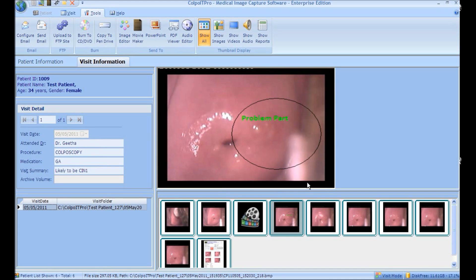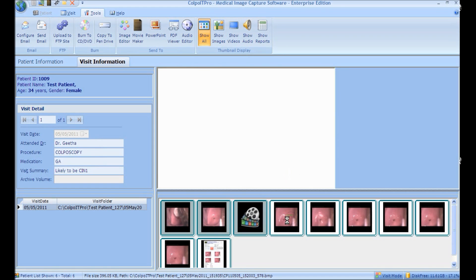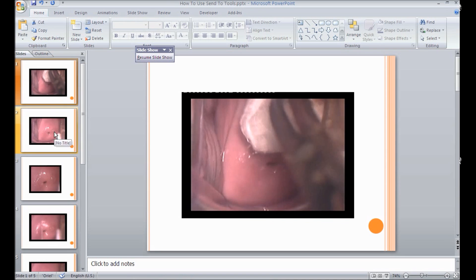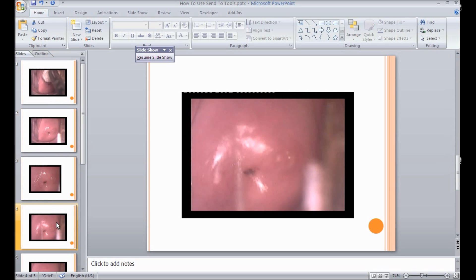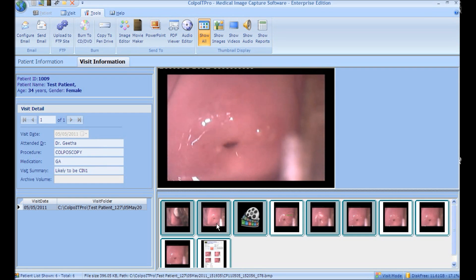PowerPoint: for presentation purposes, PowerPoint will be helpful. Select the images and video to be presented and click the PowerPoint button. The selected data is added and displayed as a slide. PDF Viewer: to view the selected report, click the PDF Viewer button. The application is integrated with Adobe Reader for easy viewing.